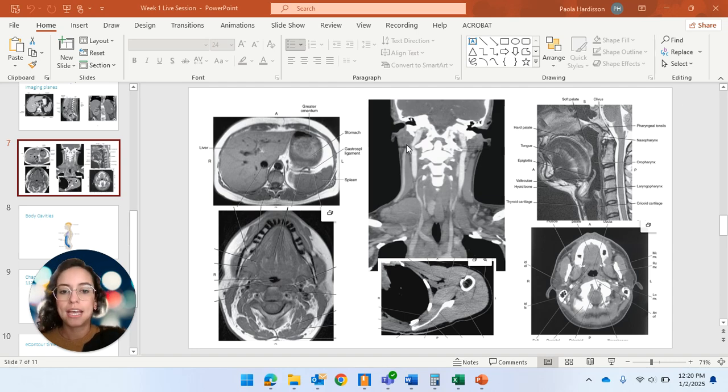So when we're looking at imaging, especially three-dimensional imaging, you're going to have different types of slices. It could be an axial view, such as this one, a coronal view, such as this one, or a sagittal view, such as this one. And each one will tell you two dimensions, right? Because three-dimensional images means you have three planes, but each individual image only has two directions. It is only when you have all three together that you're able to actually use the advantage of three dimensions. So individually, each image is going to allow you to know two dimensions.